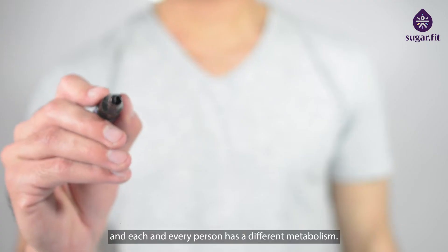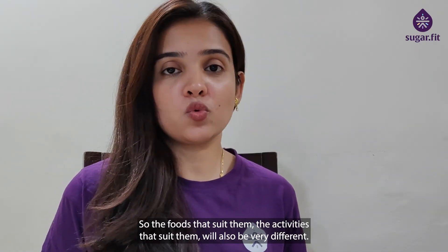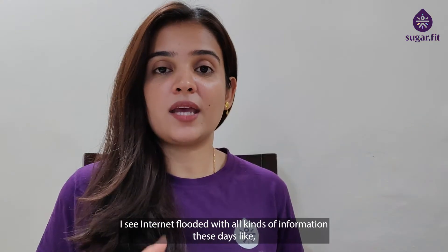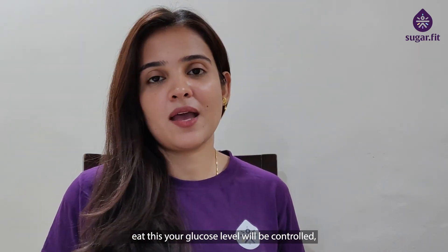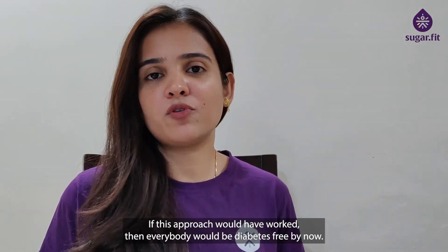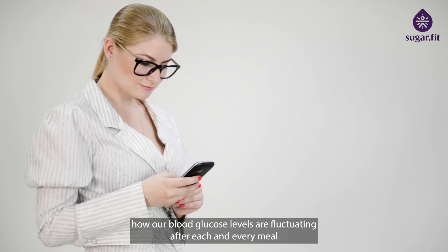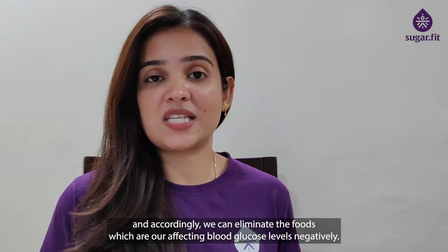Diabetes is a metabolic disorder and each and every person has a different metabolism, so the foods and activities that suit them will also be very different. The internet is filled with all kinds of information — drink this water, eat this, and your glucose levels will be controlled. But it doesn't work like that; if it did, everybody would be diabetes-free by now. CGM brings in the personalization element, wherein we can actually track how blood glucose levels fluctuate after each and every meal and accordingly eliminate the foods which are affecting blood glucose levels negatively.